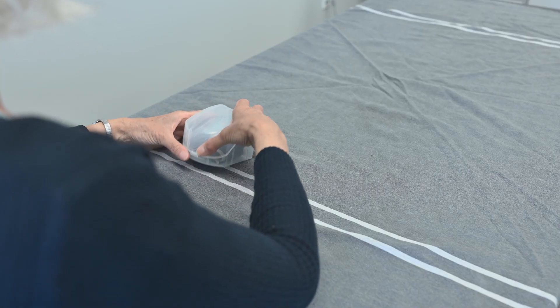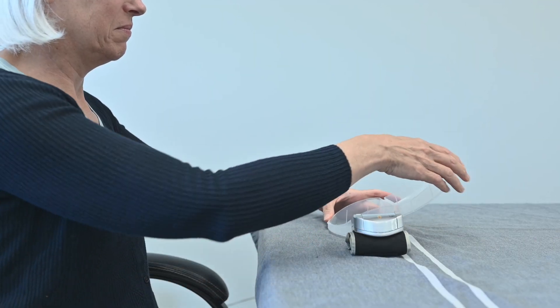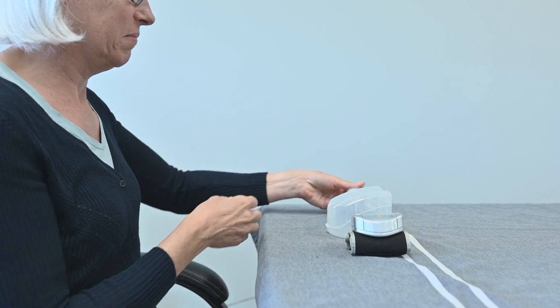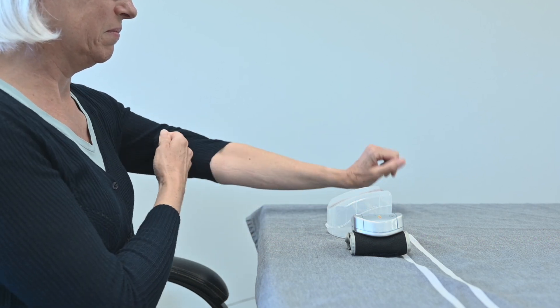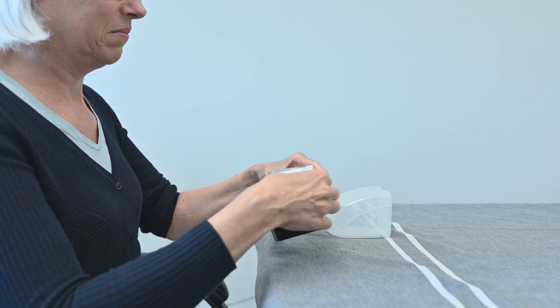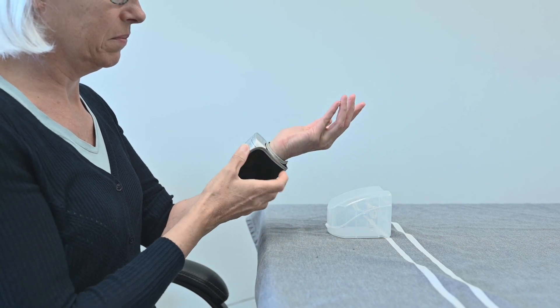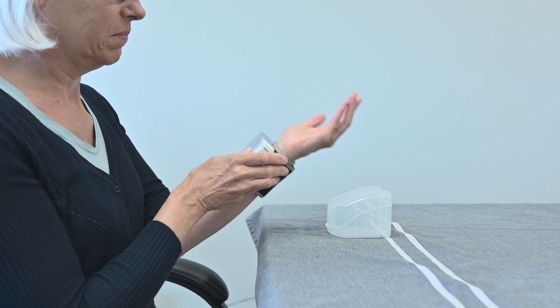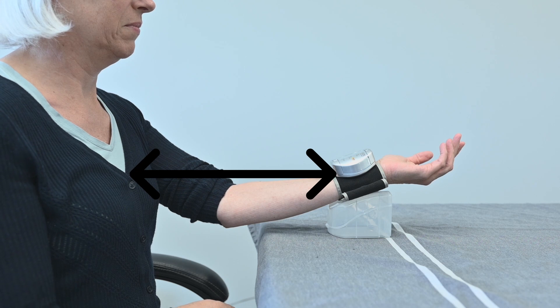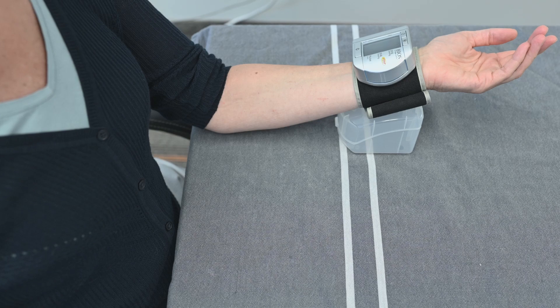It is important to be calm and not be affected by mental stress that can influence your blood pressure. Remove any accessories and roll up your sleeve. With your palm facing upwards, strap the cuff to your wrist. The monitor should be facing up and you should be able to read the screen. It's important to have your wrist at heart level. You can support your wrist by using a rolled-up hand towel or the storage case included in the box.